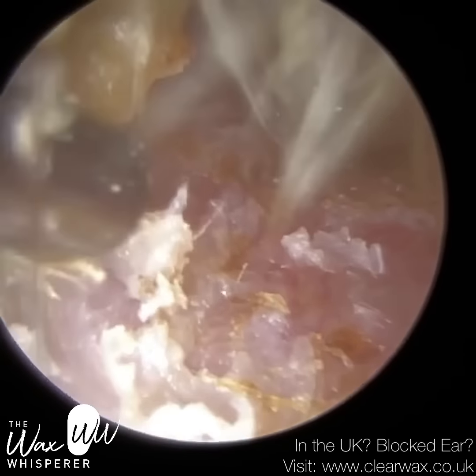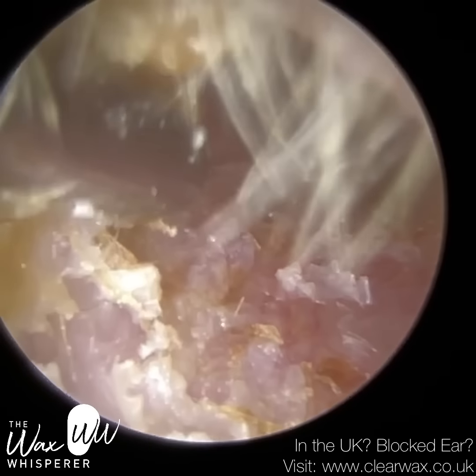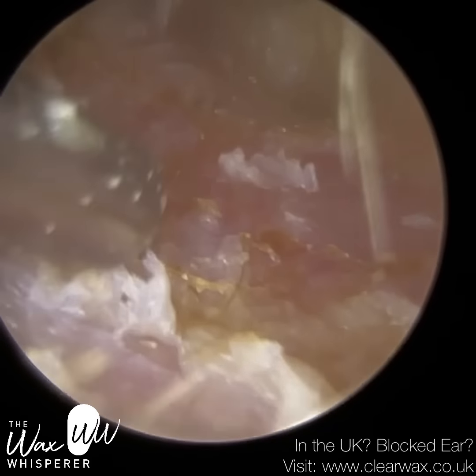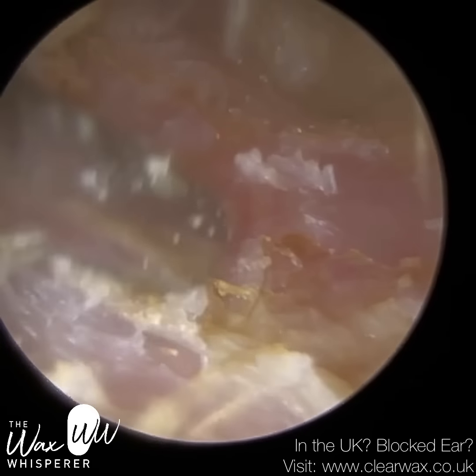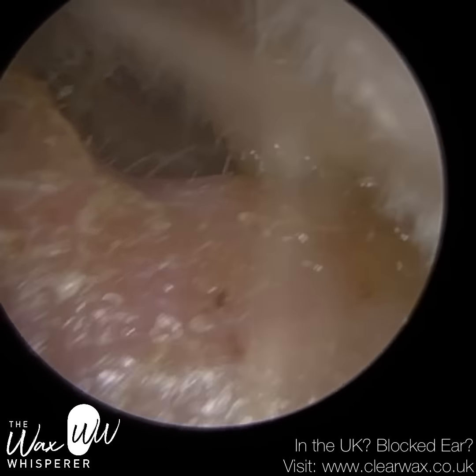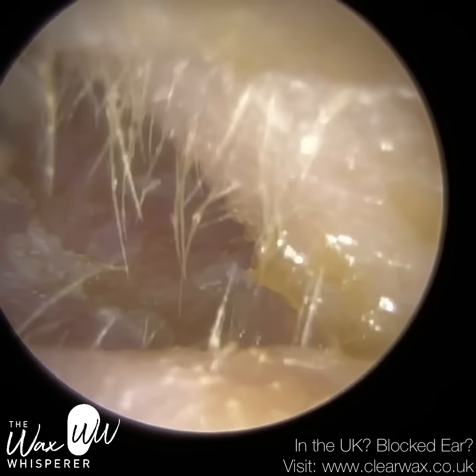You can see I'm just using the fine end just to get all this skin. Now, the skin is obviously just soft and soggy. It's just coming away from the canal wall because the patient's ear was full of discharge, all that moistness. You saw the inflammation at the entrance of the ear and all the discharge at night.